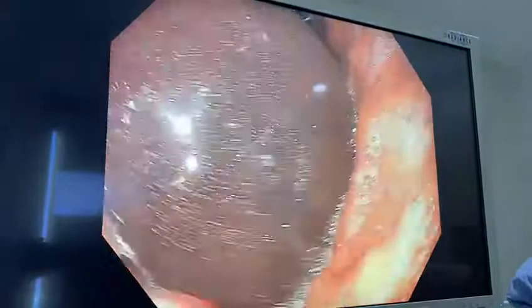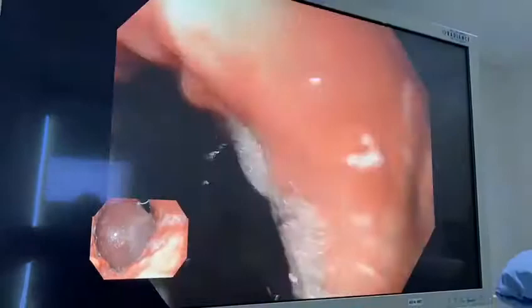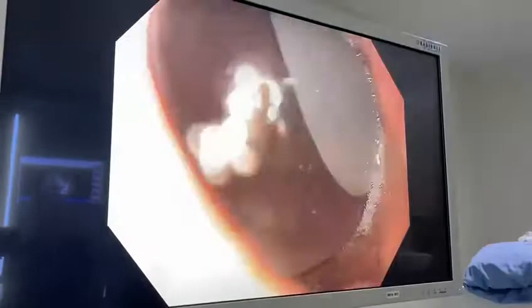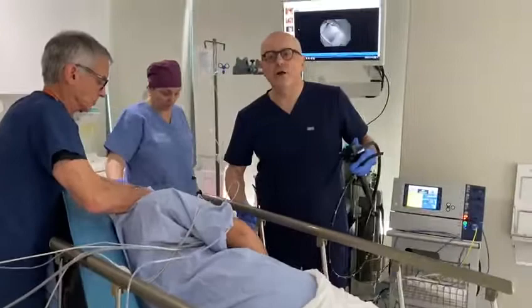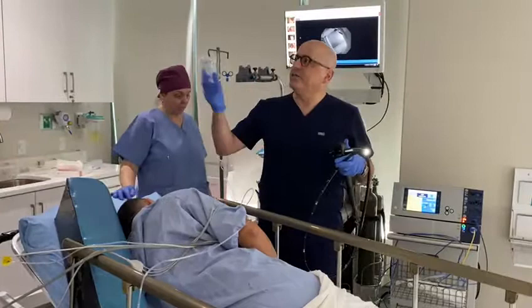Everything went perfectly. I'm going to withdraw the scope now. There's the balloon from the straight-on, head-on view. Everything went perfectly. We are done with the procedure. This patient is going to go to recovery now. We're going to watch him for about 30 to 60 minutes and hydrate him with some intravenous fluids, and then he's going to go home.